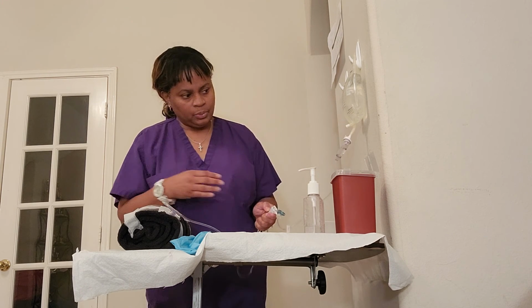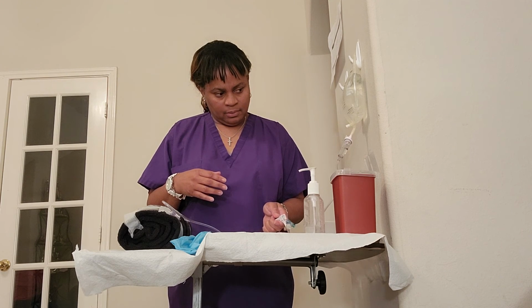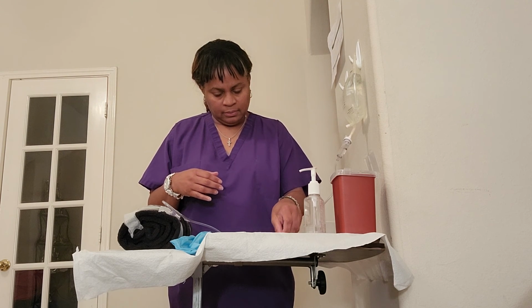Okay, so that's 21 drips per minute. I have it set.